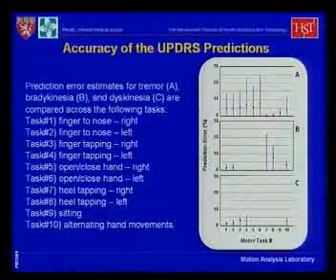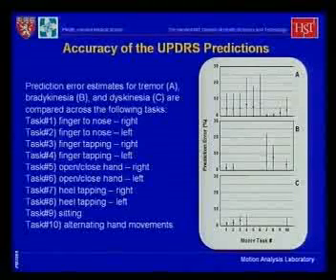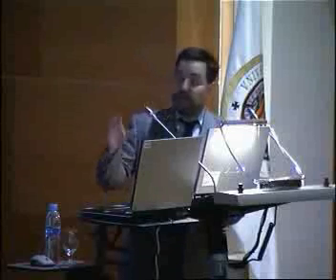So after we run projection algorithms and look at the graphical representations of features in this feature space, we actually utilize a classifier. Then we can actually show prediction errors. And the errors would be, in this case, discrepancies between the assessment of a clinician and the assessment that is performed by utilizing this sensing technology.